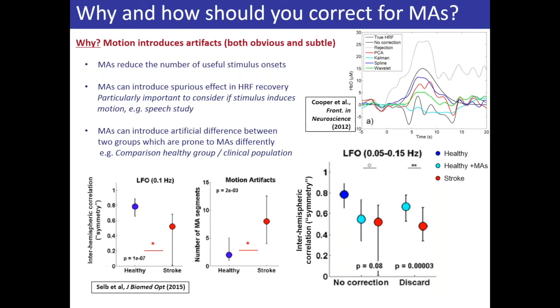And then finally what she did is she totally removed those parts of the signal. Healthy didn't have it in the beginning, but she also removed the parts from the stroke patients, and then she compared the two signals. Now you can imagine these are two clean signals, and then she saw a difference, and now we can call it a true difference in physiology between these two patient groups. So this is something to be careful about, not something that will come to mind right away, but it will be good to take that into consideration if you're comparing two different populations.